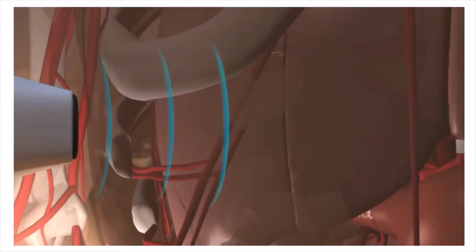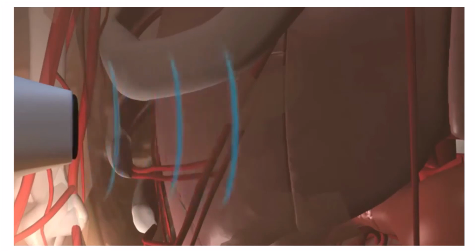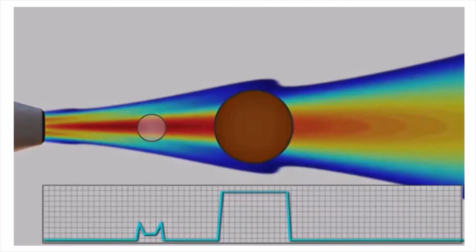When a transducer directs ultrasound waves into the body, they pass right through the skin and into the internal anatomy. As the waves encounter tissues with different characteristics and densities, they produce echoes that reflect back to the piezoelectric crystal. This happens more than 1,000 times a second. Returning echoes are converted to electric signals, which a computer converts into points of brightness on the image, corresponding to the anatomic position and the strength of the reflecting echoes.